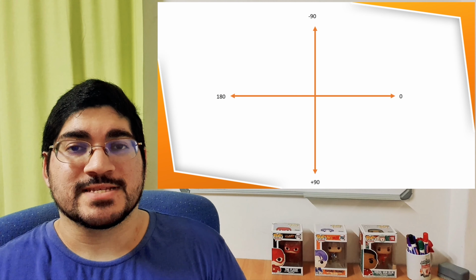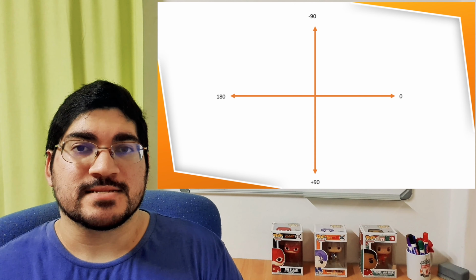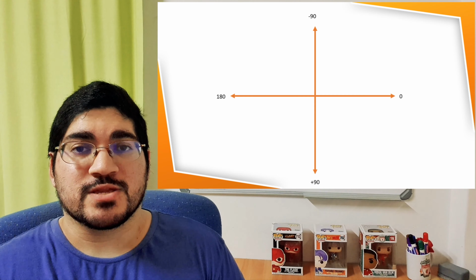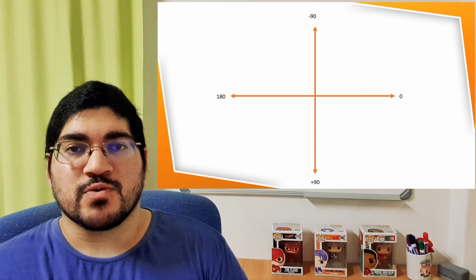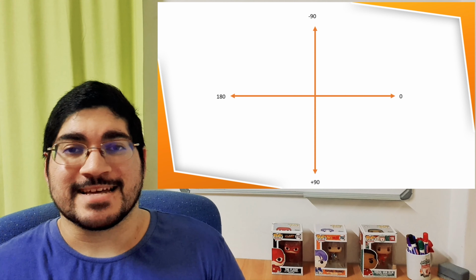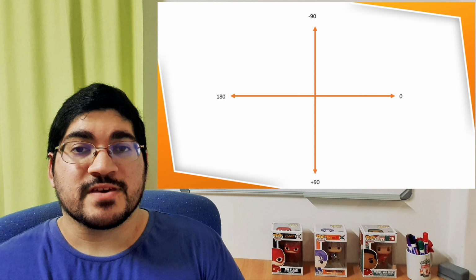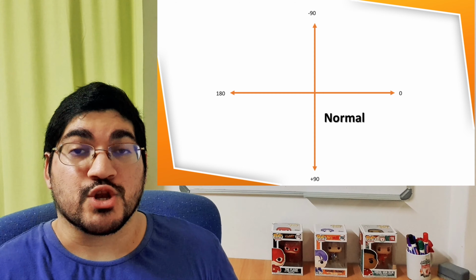First, we're going to start off with what normal values are for QRS axis and what abnormal values are. Now, if you look at the diagram right here, you can see the actual coordinate system we use for calculating the QRS axis. You'll see we start at 0, and as you come down and around, you get to 180, right? So that's from 0 to positive 180. Now, if you go on the top from 0 to 180, that's negative. So from 0 to negative 180. Now, if the QRS axis is between 0 and 90, that we call normal.